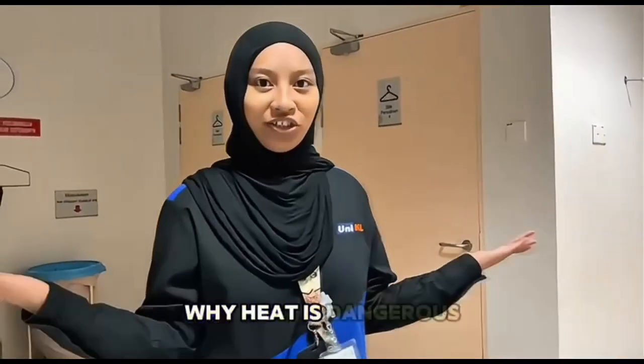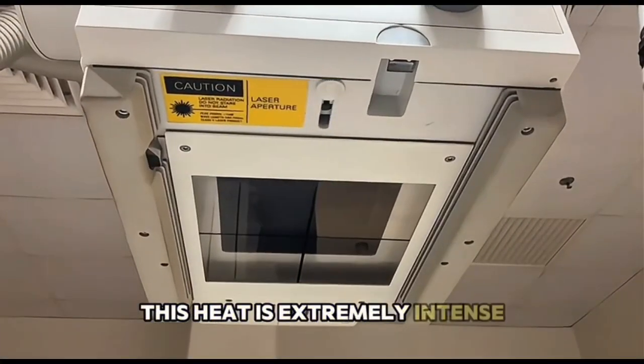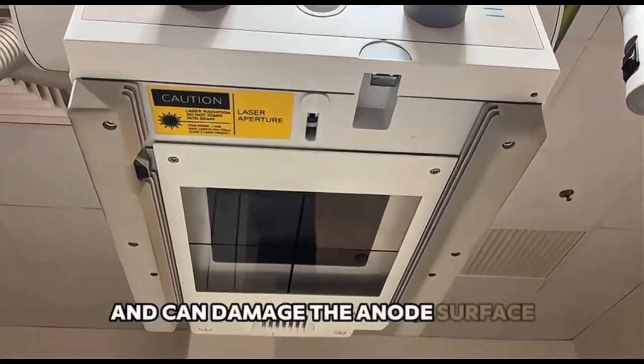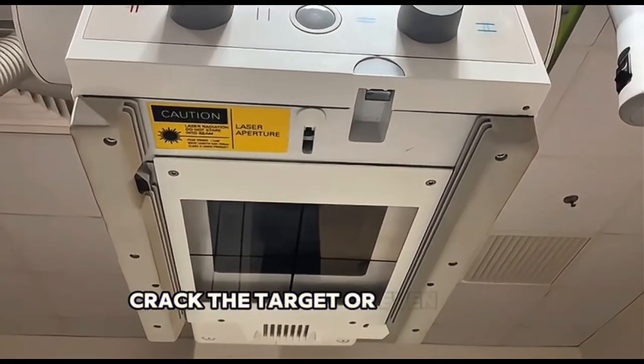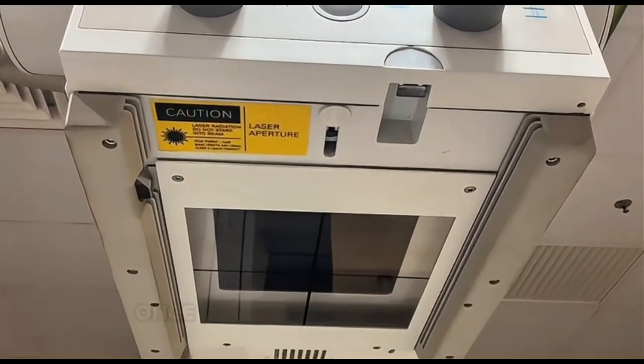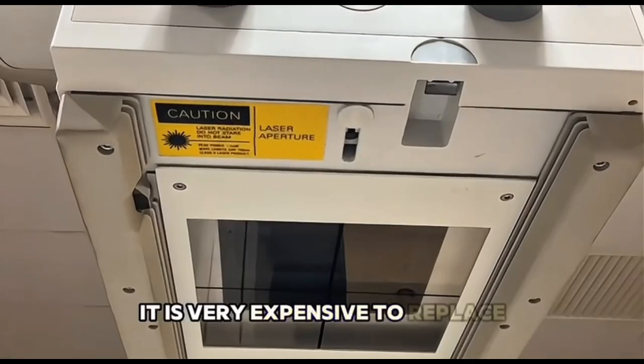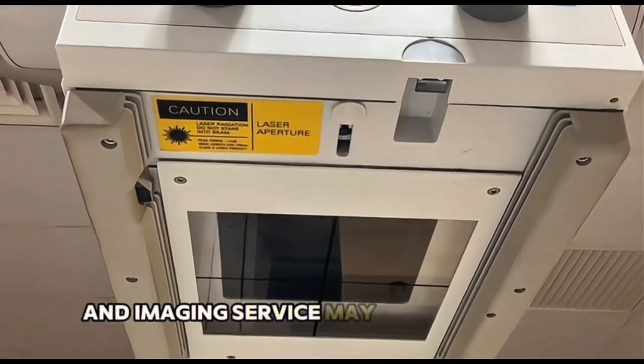Why is heat dangerous? This heat is extremely intense and can damage the anode surface, crack the target, or even cause permanent tube failure. Once the X-ray tube is damaged, it is very expensive to replace and imaging service may be interrupted.